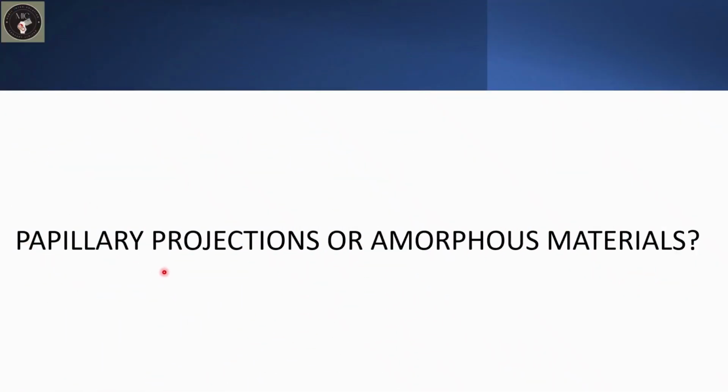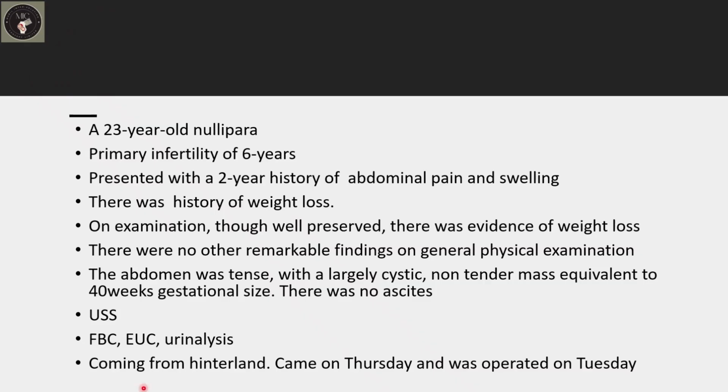Papillary projections or amorphous materials. This was a 23-year-old with primary infertility. She presented with a 2-year history of abdominal pain and swelling.